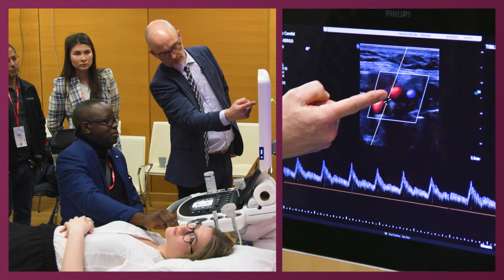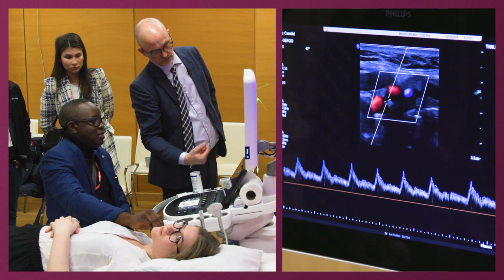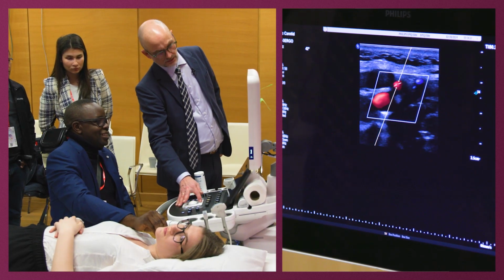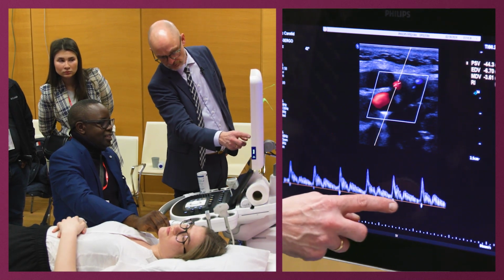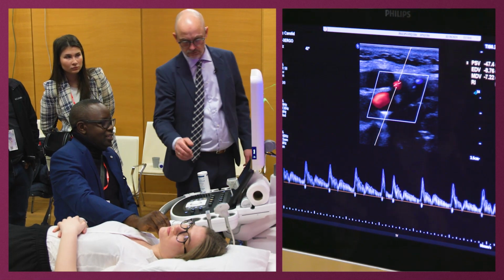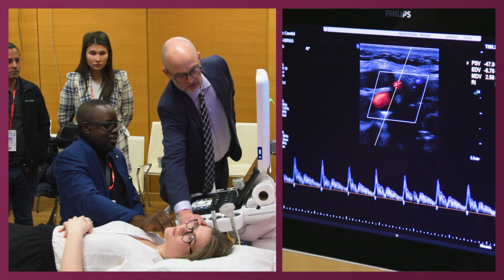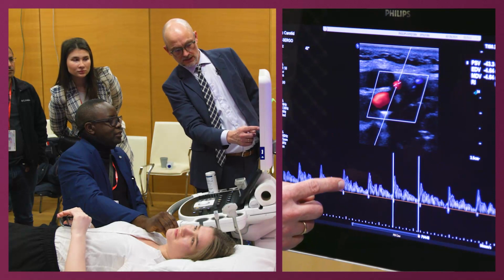I think this is probably the external in a kind of cross-sectional view. Should we check it? Let's see. You see, this is impossible if it was for the brain. You have a kind of reverse flow. So if you're in doubt, I'm touching you now. Let's see, it should be here. Maybe here. I think this is tapping.